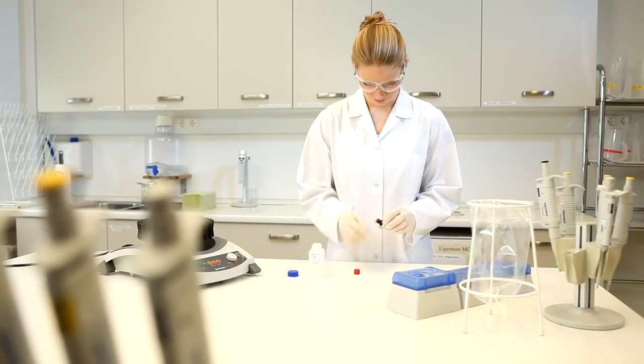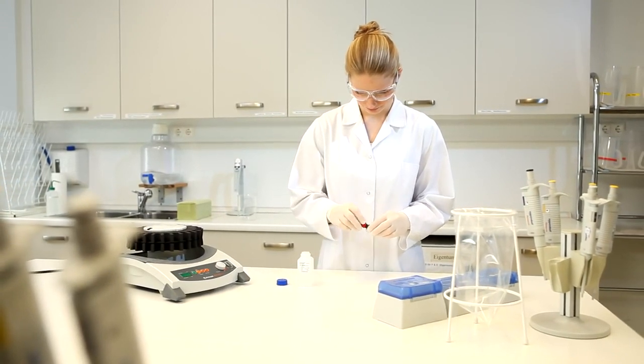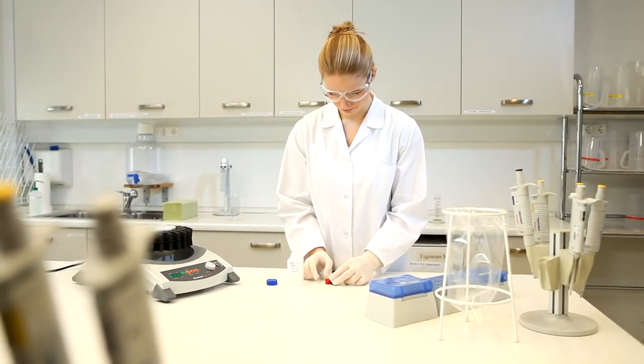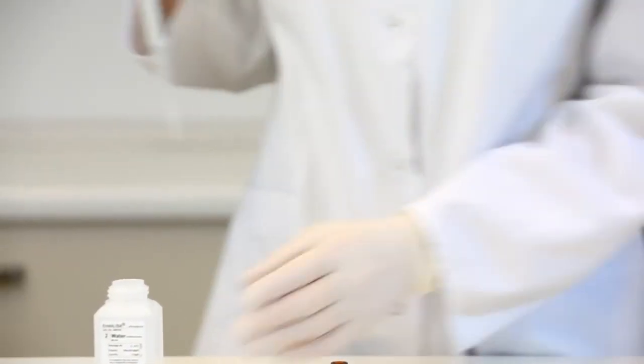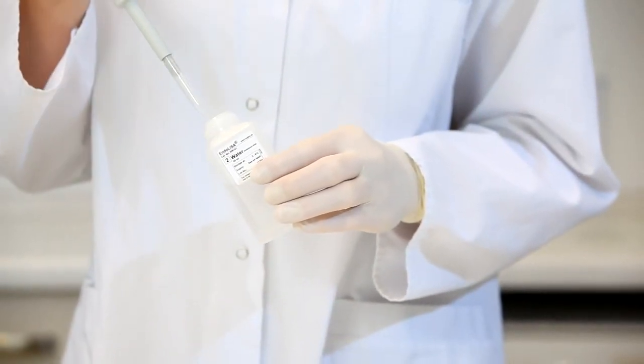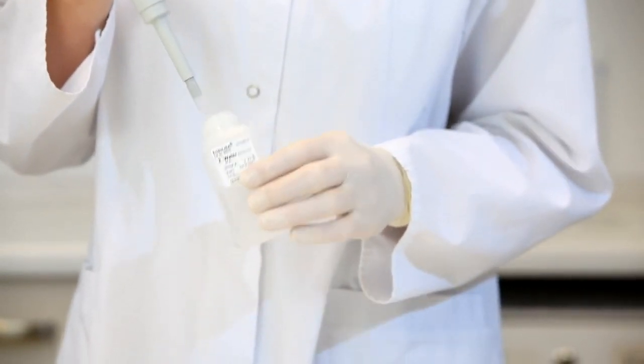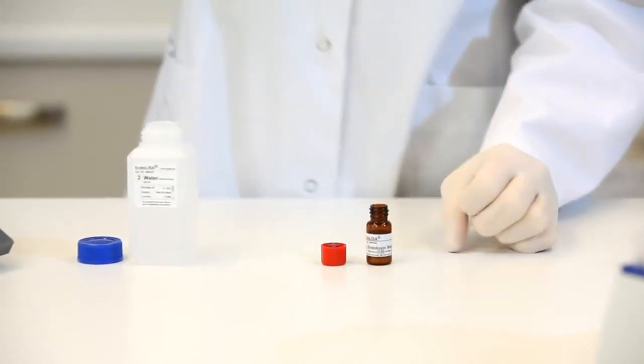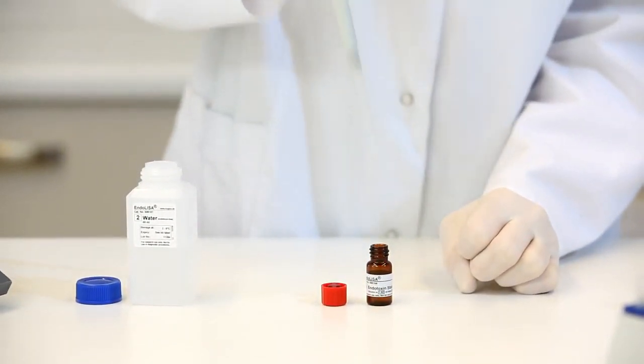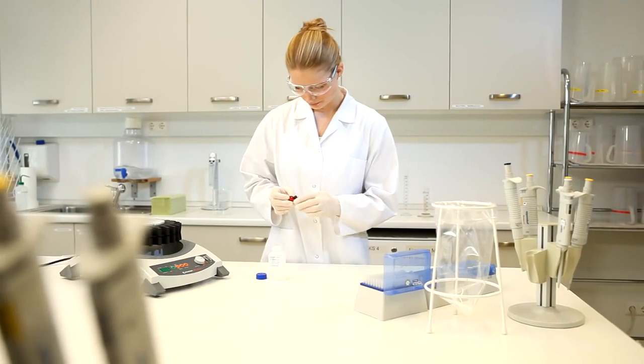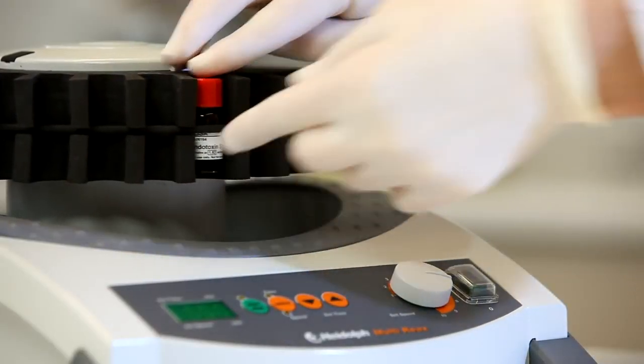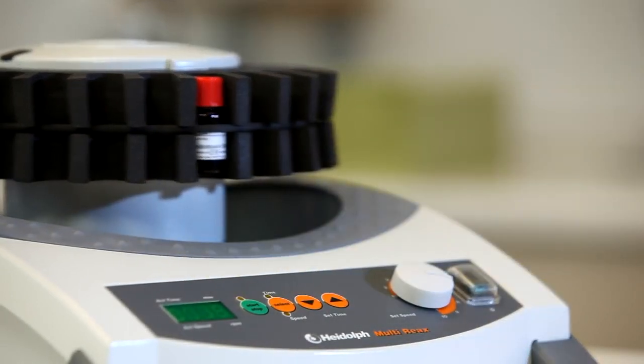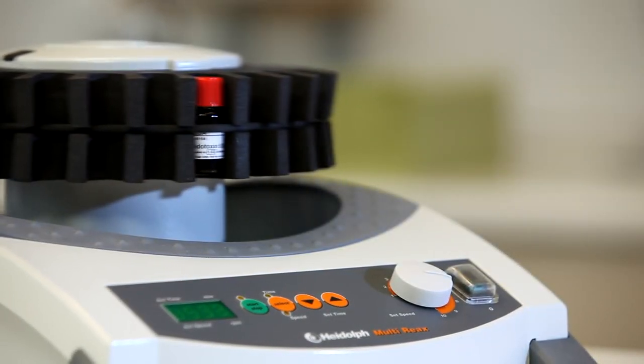Start with the preparation of the endotoxin standard solution. The exact volume of endotoxin free water required for dissolving the endotoxin standard is indicated on the label. Add the water to the endotoxin standard bottle. Close the bottle tightly and vortex thoroughly on a test tube shaker for at least 10 minutes. The endotoxin standard solution is ready. It has a defined endotoxin concentration of 500 EU per milliliter.